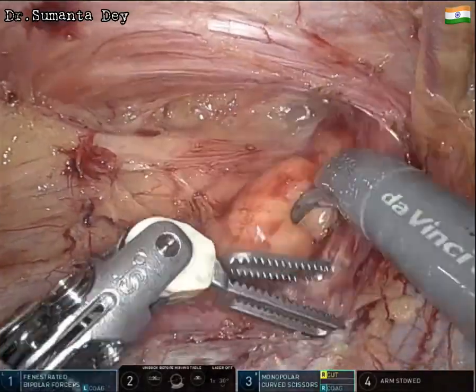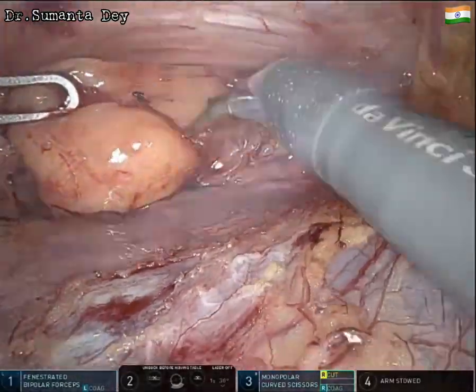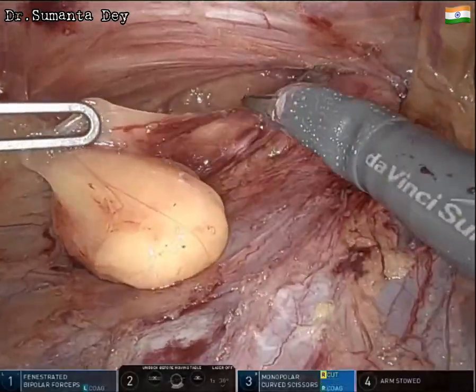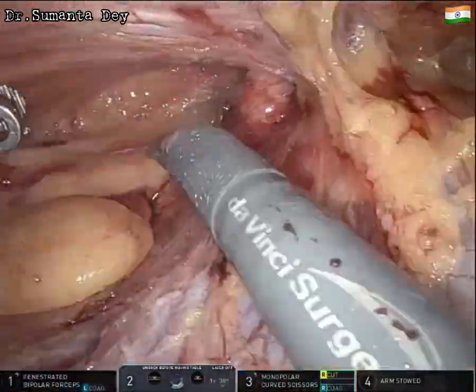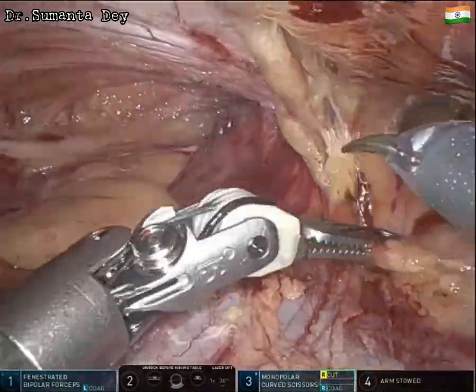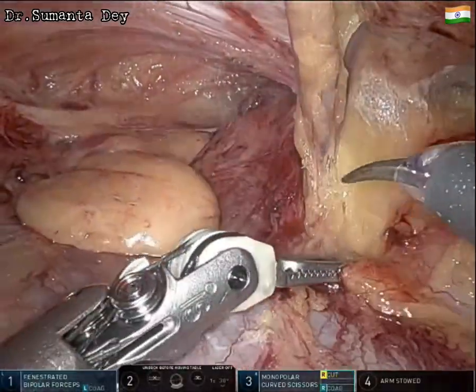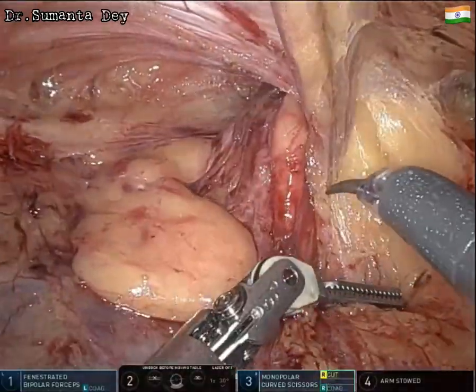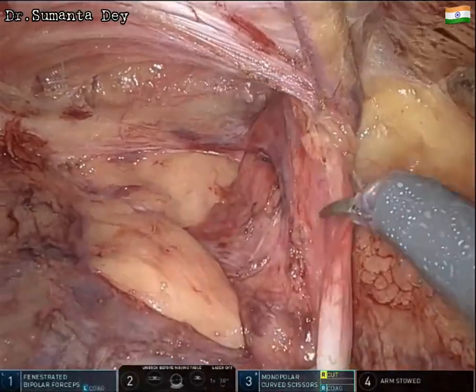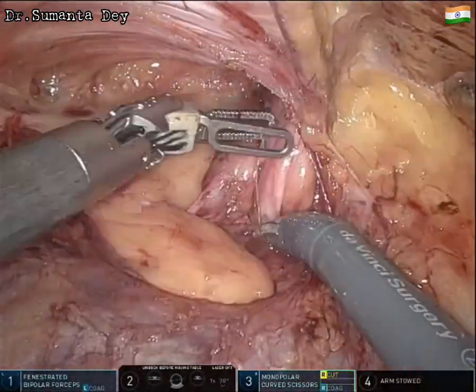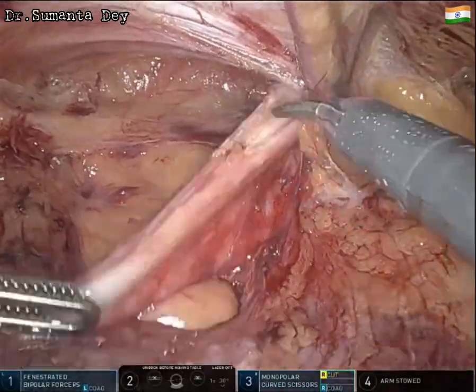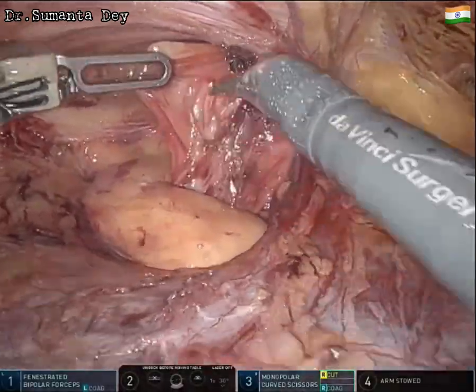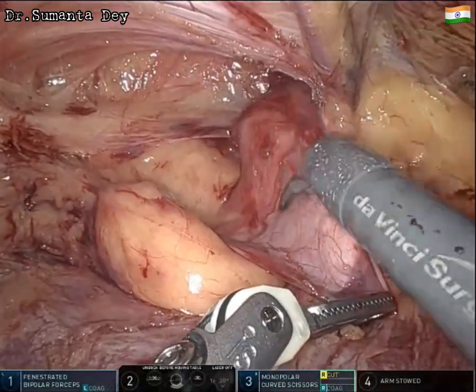The assistant is asked to apply external pressure so the sac becomes inverted towards the abdominal cavity. The cord lipoma is dissected off from the hernial sac. Keeping the inferior epigastric vessels above, all loose areolar tissue is divided so that medial dissection of the sac is also carried out slowly and gently. Continuous external pressure helps manipulate the sac from inside.